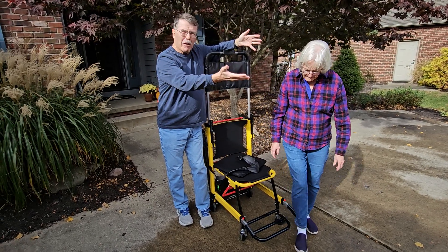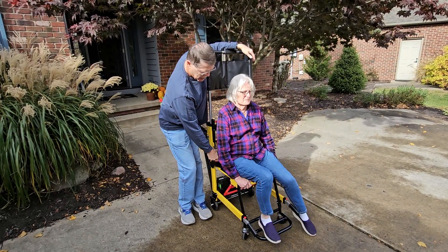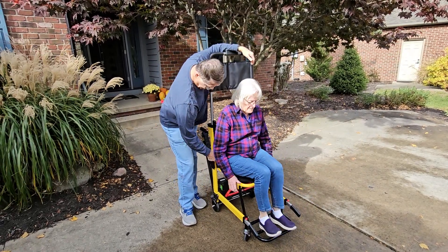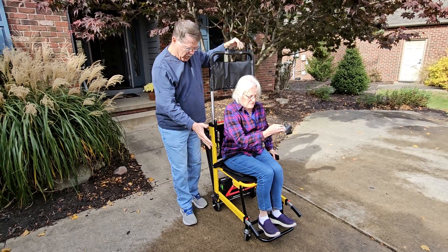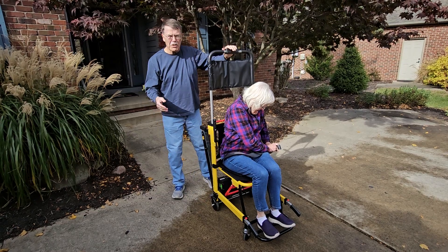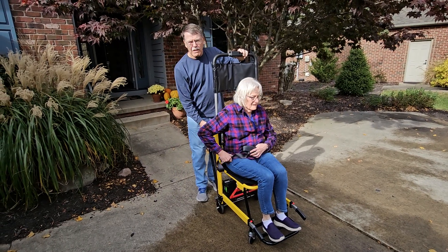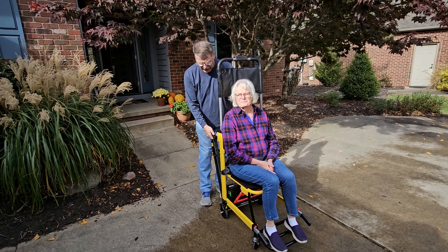So when we come to our house, you'll pull up in the driveway like this, and then this chair will be here, and you're sitting on the seat belt. We'll let you then sit down in this chair, which we just got, and then this chair will enable you to get into the house without having to go up the steps.